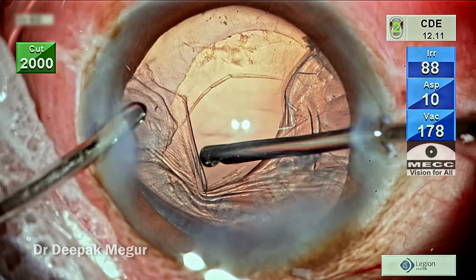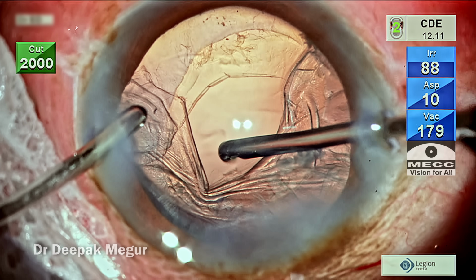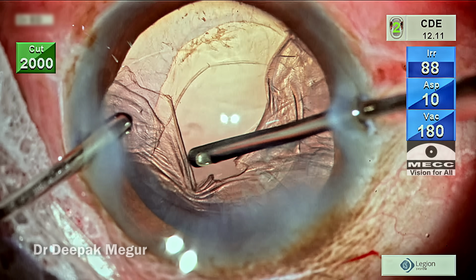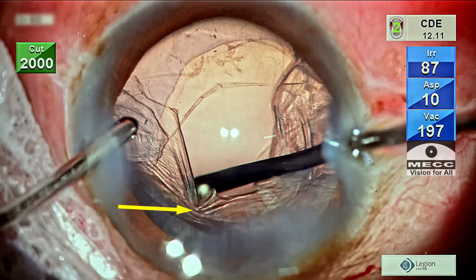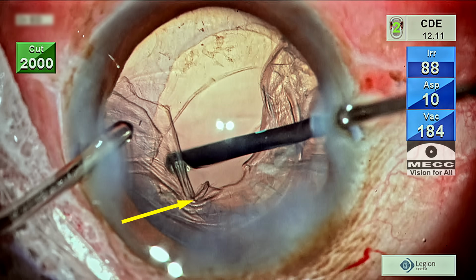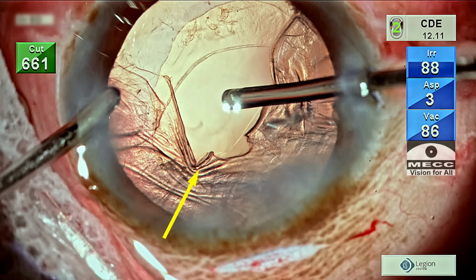So when you see a free fluttering posterior capsule tear, it is an indirect evidence that there is no vitreous near its vicinity. Whereas in the subincisional area, I'm still not very sure that it's totally free of vitreous, because looking at the configuration of this cortex suggests that there could be one fiber which is traversing across towards the main incision. There's a reason why it may not be happening.